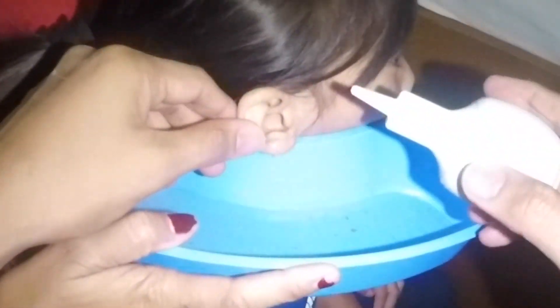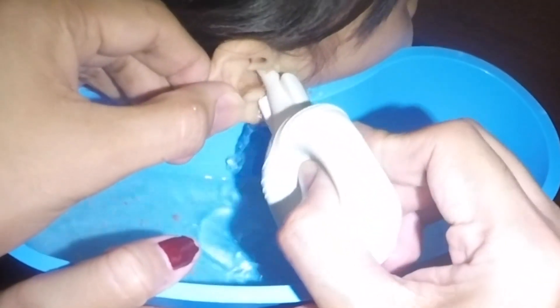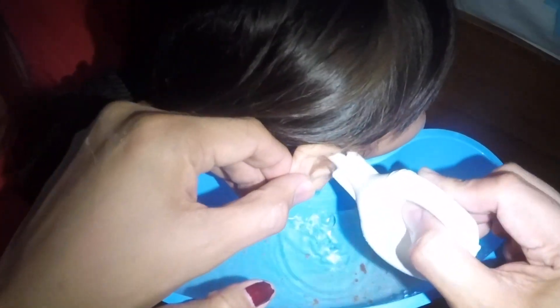It was like that. What was the difference? It was like this, it was like a little bit. Okay.